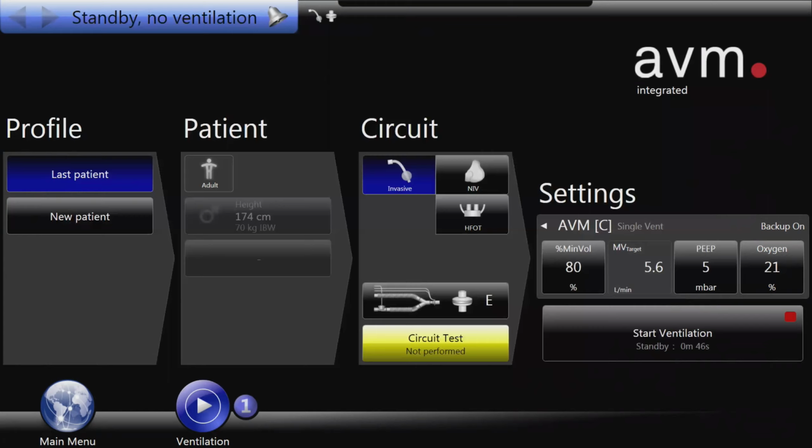So now the patient would be in an area where he's still breathing a bit higher, but he's now better supported than before. And if we have set the right setting, the inspiratory rate will decrease while the pressure support will increase.